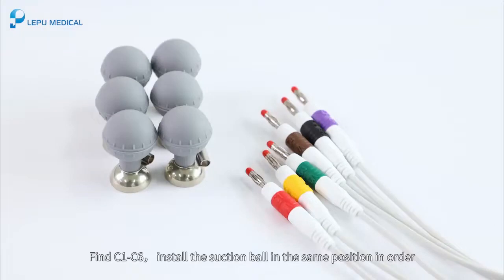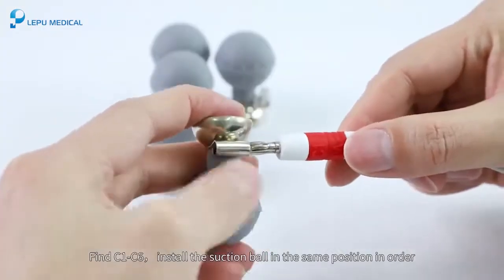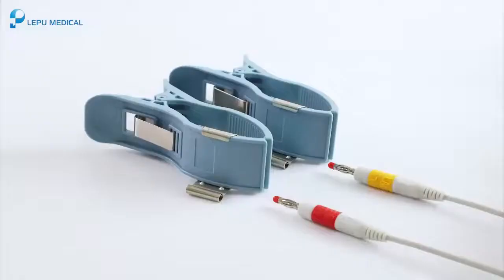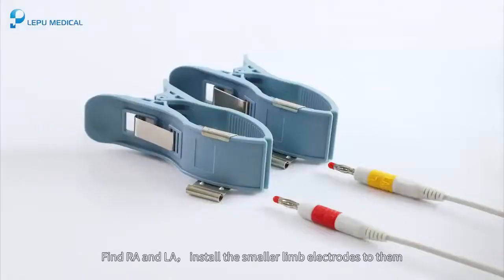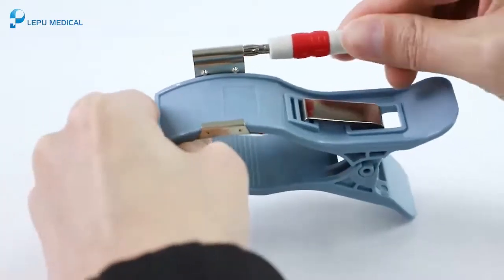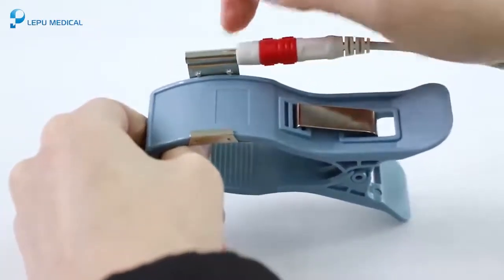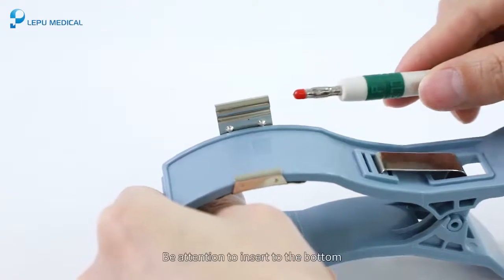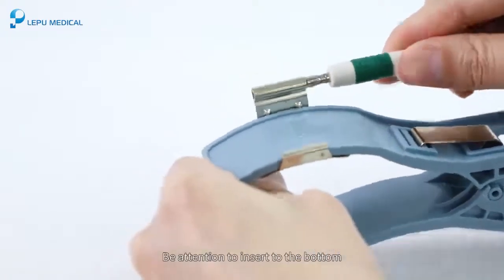Find C1 to C6, install the suction balls in the same position in order. Pay attention to insert them to the bottom. Find RA and LA, install the smaller limb electrodes to them. Find N or RF and F, install the bigger lower limb electrodes to them. Pay attention to insert to the bottom.